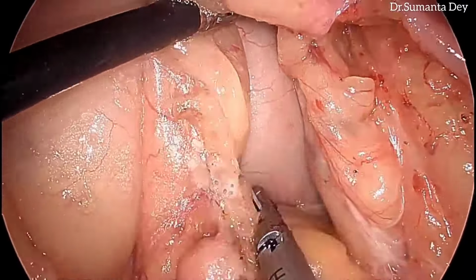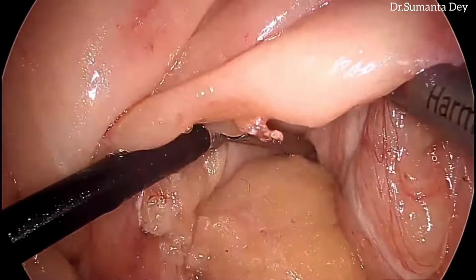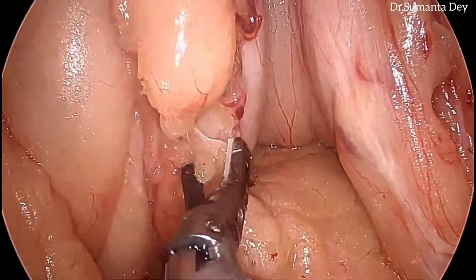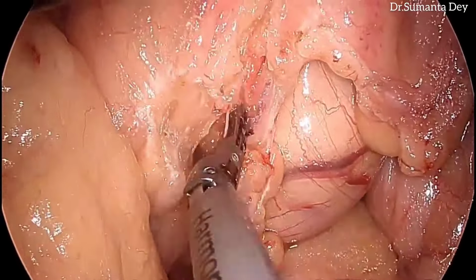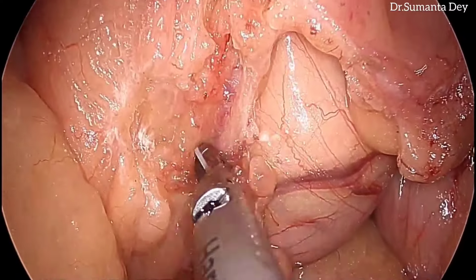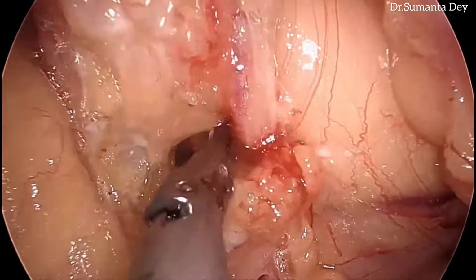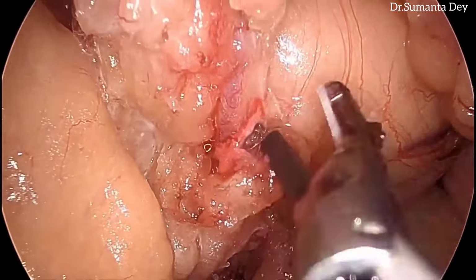So you can see the posterior surface of the stomach. The root of the mesocolon is being mobilized gradually, and on further mobilization coming towards the midline, here I am getting the left colic vein. So this is the left colic vein near the root. I am dissecting it using harmonic shears all around and the right angle forceps.